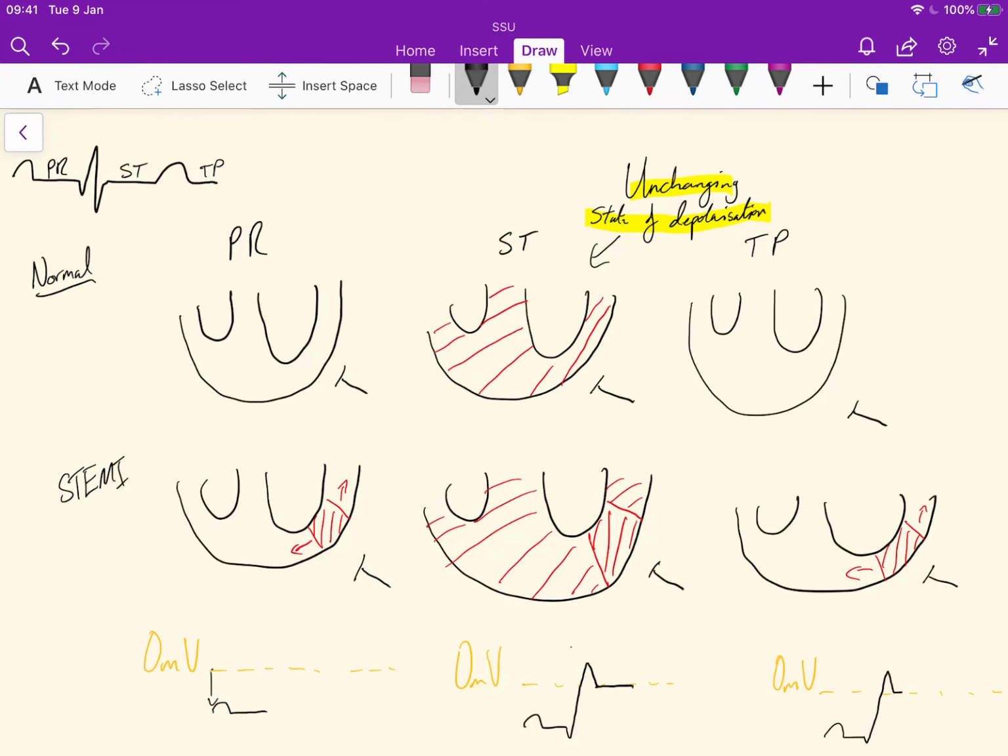So we have our T wave and it returns, let me draw that again. P wave, QRS, T wave is normal, and then it returns back to a more negative value, because now this ischemic area is able to cause depolarizing currents to move away from the overlying lead, and that's why you get ST elevation in a STEMI.